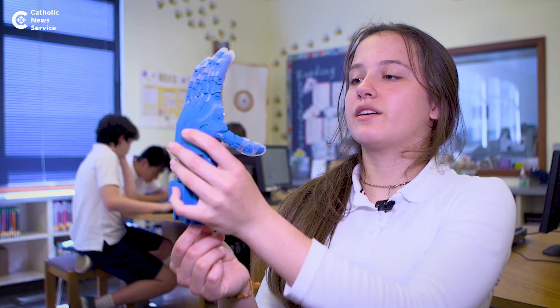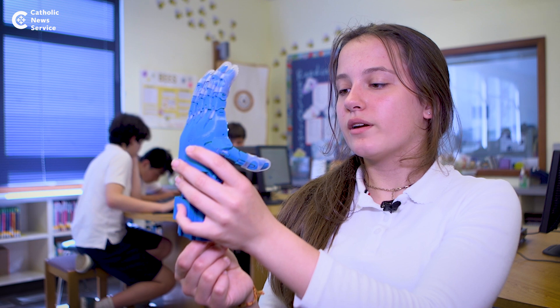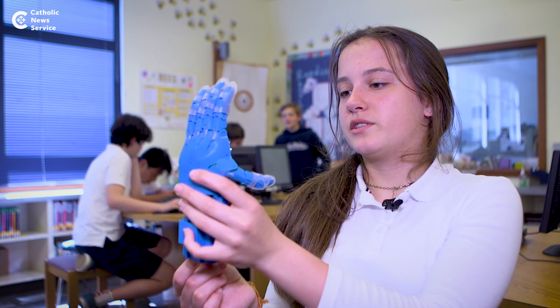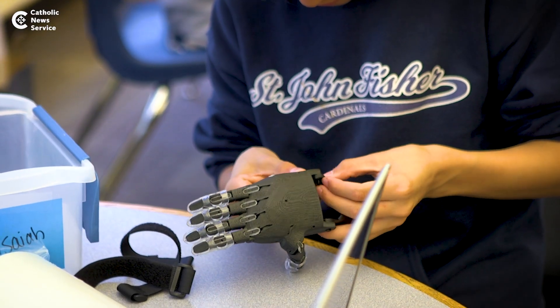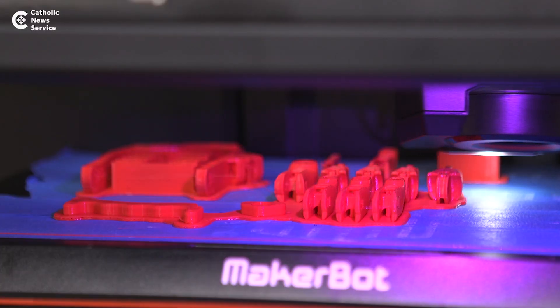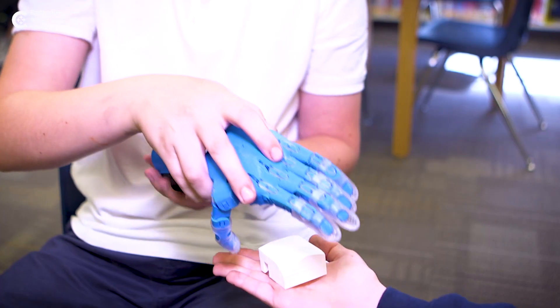I see something that could really make a difference in someone's life — maybe make them happier, or be able to do more stuff, or maybe just feel like they fit in better because they don't feel so much like an outsider since they're different from other people. When I look at this hand, I think, wow, we've made something for someone who's less fortunate than us here at St. John Fisher.